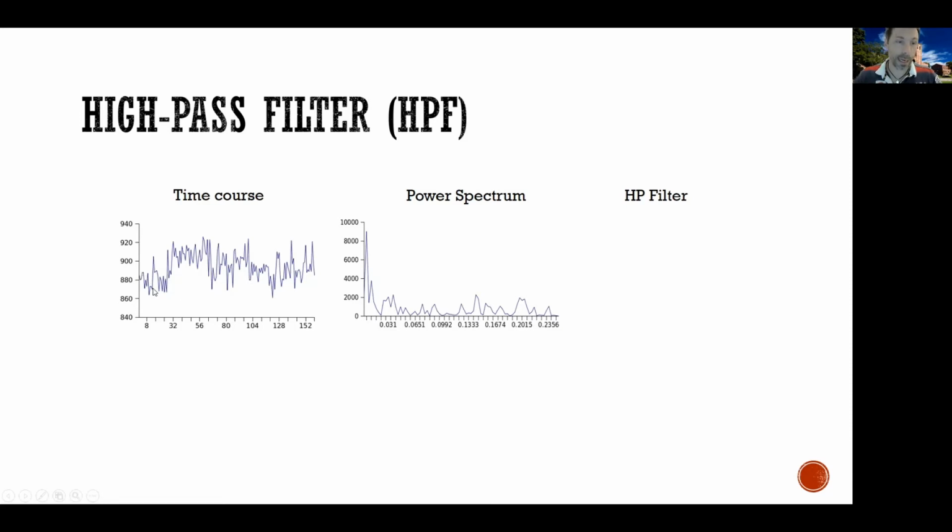Just to give you another example, but in an event-related design. So this is an event-related design. It's harder here to see where the task is because it has a jittered timing. The power spectrum looks like this. It's tough to say, but my signal is actually somewhere in here. See everything else? All this wiggling? That's too fast to be my task. It's not my task. See these two giant mountains right here? Not my task. So this is low frequency noise, and everything above is high frequency noise.